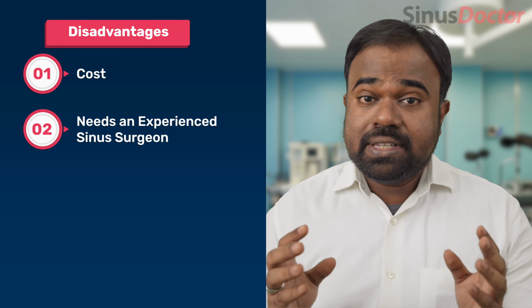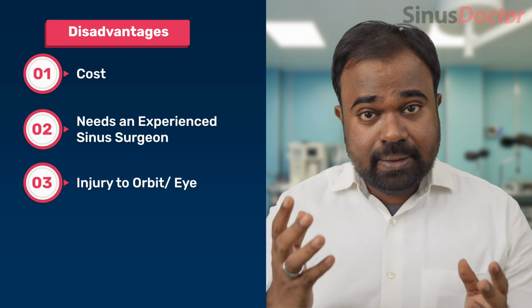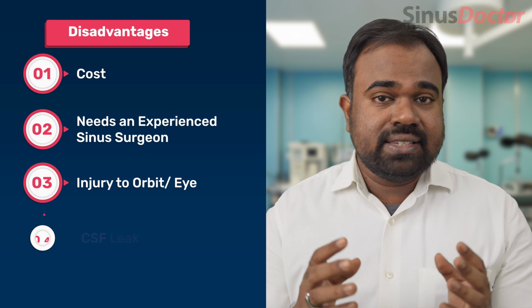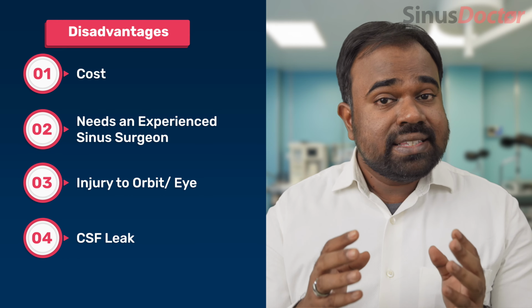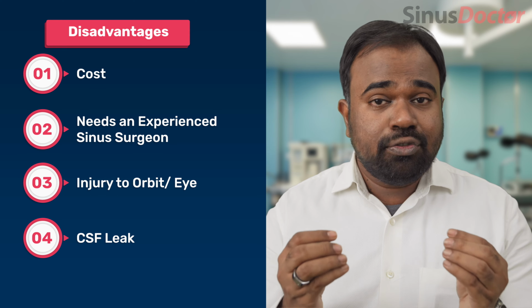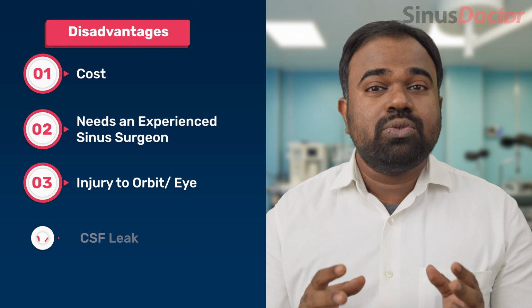If the balloon is mispositioned, it can sometimes lead to injury to the orbit, that is the eye, or it could fracture the skull base, that is the partition between the nose and the brain. And once the skull base is fractured, the CSF fluid which cushions the brain starts dripping through the nose, and this is a complication we would not like to have. At our Sinus Doctor Center at Dr. Rao's ENT, we use navigation technology to our advantage to locate the sinus drainage opening before we pass the balloon. This greatly reduces the chances of complications of balloon sinuplasty.